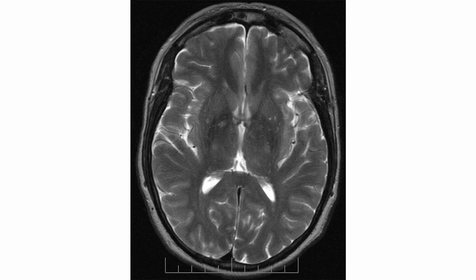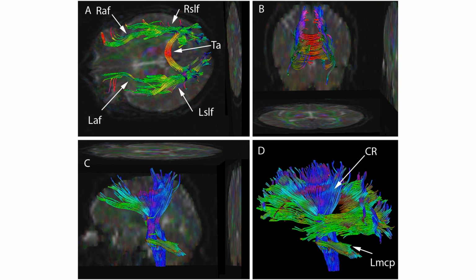Figure legend. Diffusion tensor imaging data have been used to seed various tractographic assessments of this patient's brain. These are seen in superior, posterior, and lateral views. The seeds have been used to develop arcuate and superior longitudinal fasciculi, and for brainstem and corona radiata, and as combined datasets. Some of the 2-dimensional projections of the tractographic result are also shown.